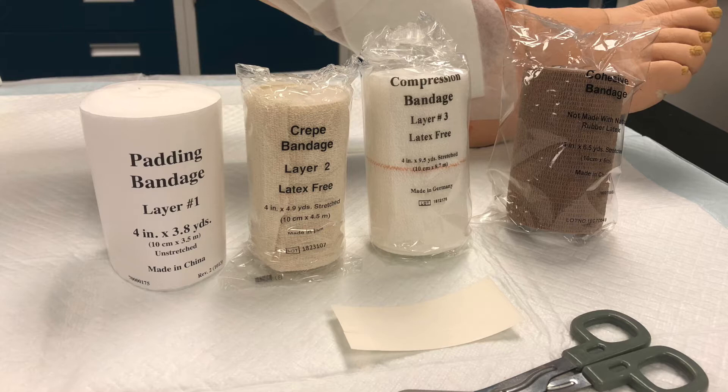The ForePress compression bandaging system is indicated for the management of venous leg ulcers and related conditions. The system, when applied as directed, provides compression for seven days. The sub-bandage pressure at the ankle, if 21 centimeters in circumference, will be in the 30 to 40 millimeters of mercury range. Sub-bandage pressures will be slightly higher when applied to an ankle with a smaller circumference, and slightly lower when applied to ankles larger than 21 centimeters.